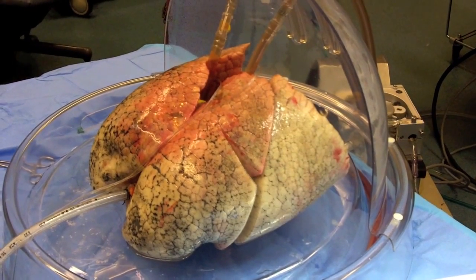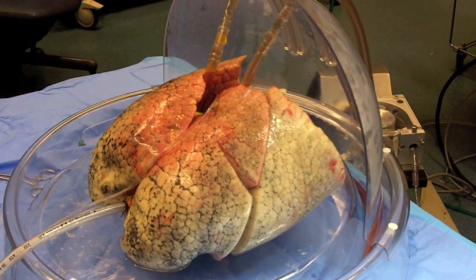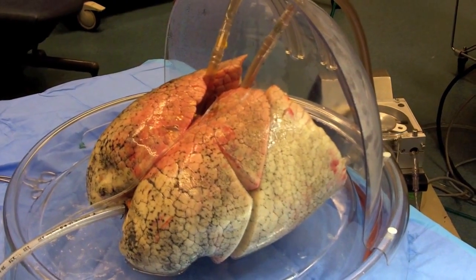What it has shown is that it has brought the concept of being able to keep an organ outside the body maintained in a way that we can measure it, we can assess it, we can allow it to recover of its own natural recovery techniques, but also we can facilitate recovery of that organ or enhance its recovery. So really perhaps allow us to make organs that are even superior to the way that we found them.